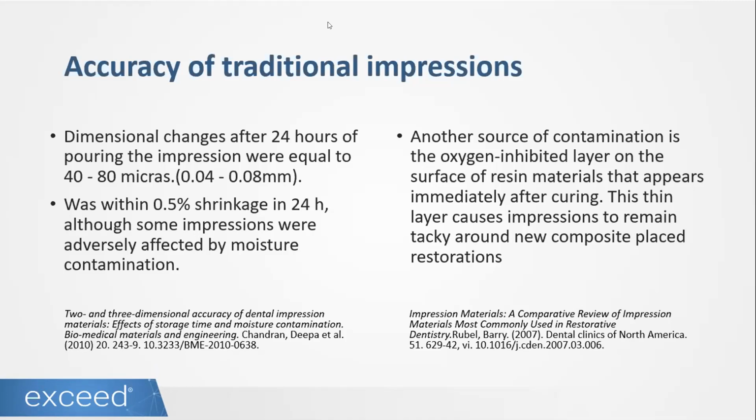So it is important that when you do that, you may have a distortion of the place where you did that composite. This happens because we have the oxygen inhibition layer in there. So if you're going to take that impression of the teeth that you restored on that same day, always remember to use glycerin in the final light curing, and then to scrub that surface with a little bit of alcohol. By doing that, you can make sure that you are not going to have a distortion in your PVS.